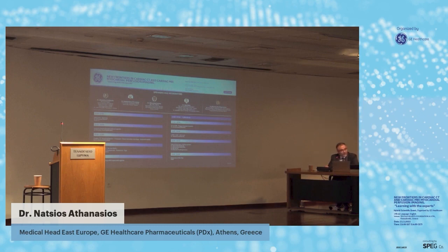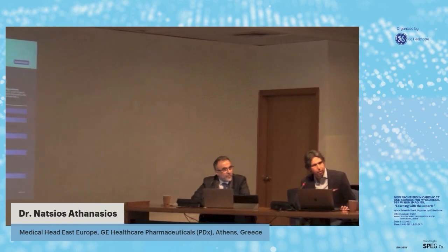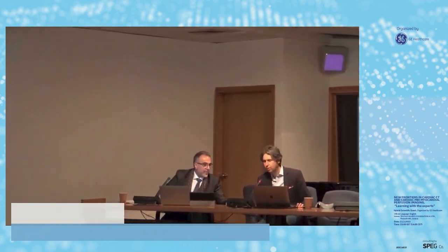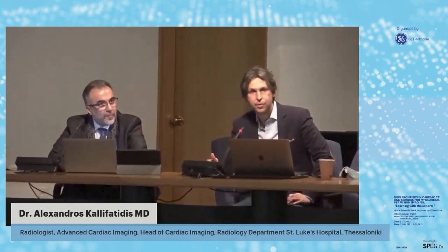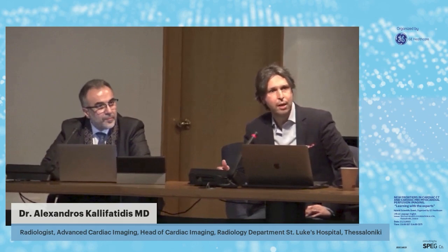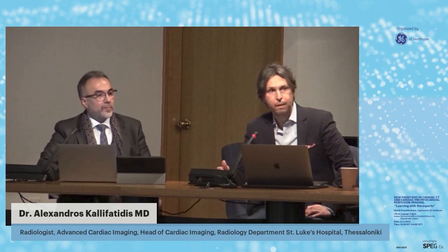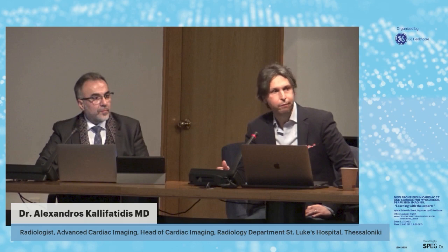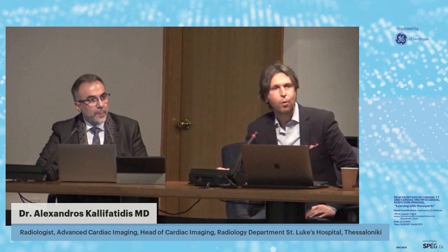Perfect. Is there any specific site that is more probable to produce artifacts during a good examination? Of course, yes, very good question. Arrhythmia could be a source of a lot of artifacts, especially severe arrhythmia. If it's mild, of course, there are arrhythmia rejection techniques from the scanner. We can use triggering, and we can improve our image quality, so our diagnostic confidence. But if we have severe arrhythmia or tachycardia, or if the patient cannot collaborate with the breath hold, then we can have artifacts that could affect our diagnosis.